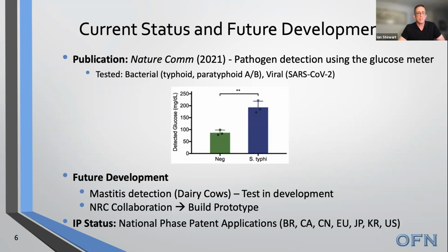So basically, you take the sample and a portable unit out to the site where the samples can be processed. It only takes a couple of microliters, certainly less than a couple hundred microliters of sample, to get a readout. At the end of it, you get the readout from the gene circuit, and you just load that onto the glucose meter to get your readout. You can multiplex this as well, or do it sequentially, but you could do a large number of samples within a relatively short period of time.